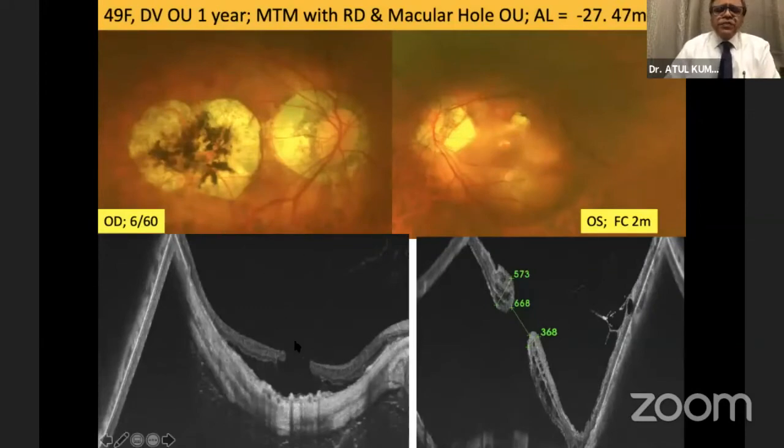So these are the kind of patients we often see with bilateral pathological myopia with hardly any contrast. The only way to pick them up is these imaging techniques which we are highlighting in this session. This is an OCT which shows the macular hole over here in the schisis. The macular hole is there, and this is not retina which is detached. These are actual schisis. And there's another eye, the left eye, which is having a detachment. The retina is lifted up, and it's also got a hole on one of its slopes. So you've got to manage it at the slope.